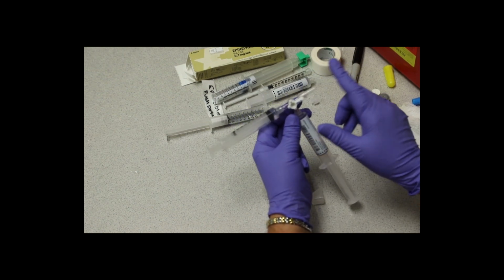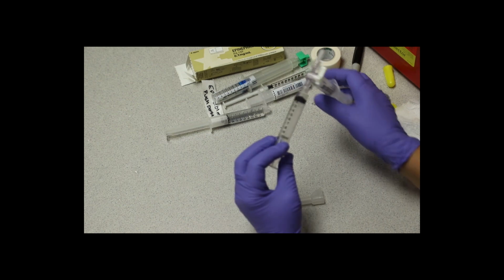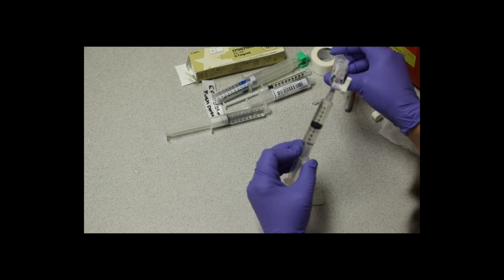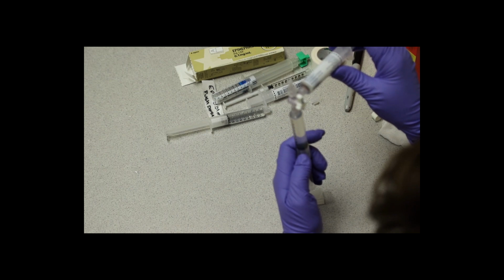And make sure you shut off the other port so that fluid doesn't go out to that side. And you're going to push your 9 mLs of normal saline to make this a total of 10 mLs.